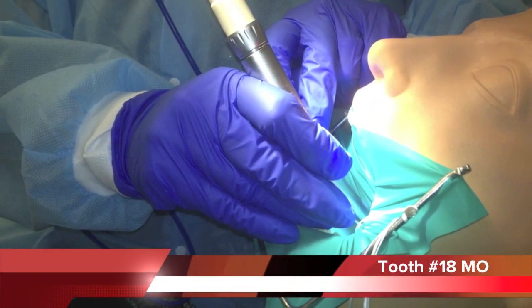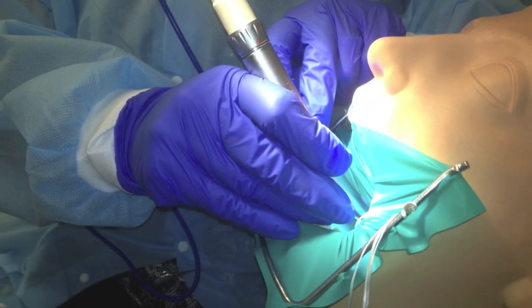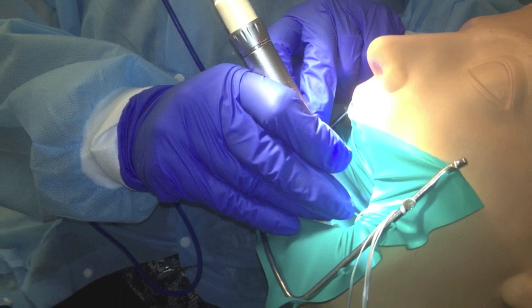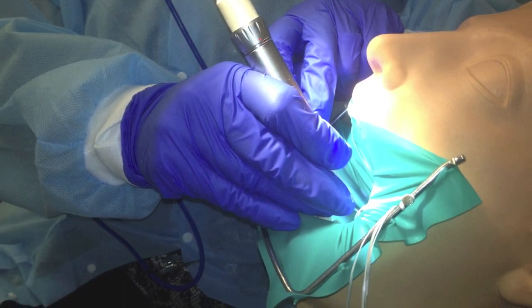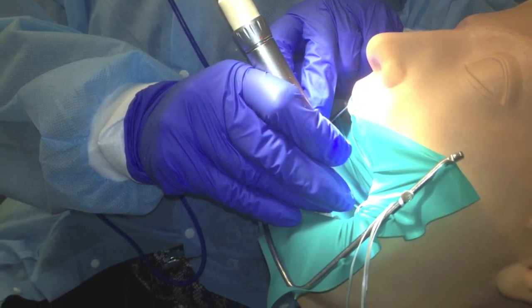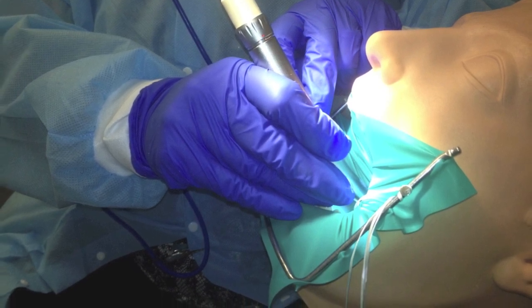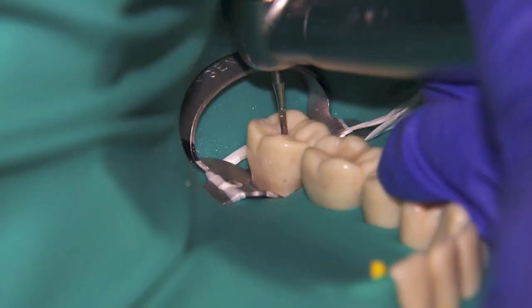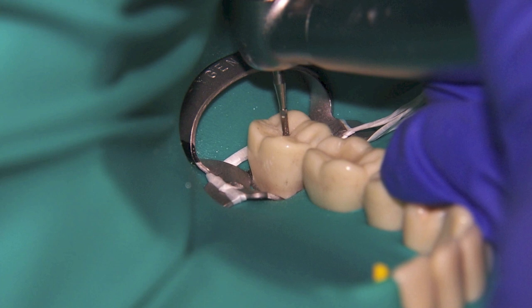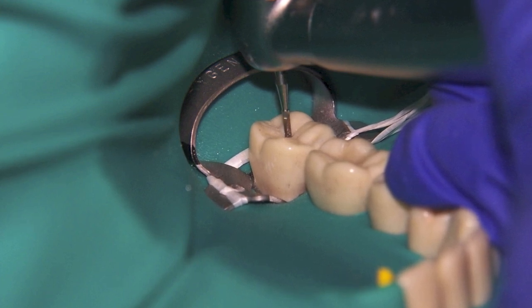To access tooth number 18, the patient is seated in a semi-supine position with the mandibular occlusal plane parallel to the floor. In this position, a fulcrum is established. The bur should be placed perpendicular to the occlusal plane of tooth number 18.